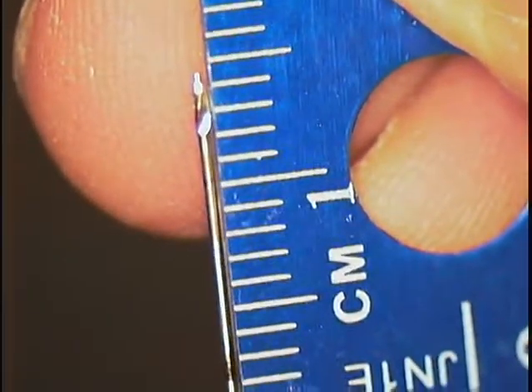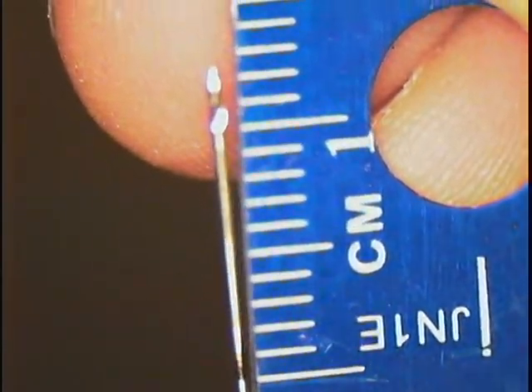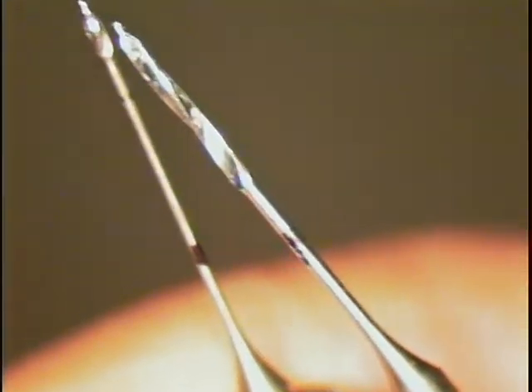So take your burr and your Sharpie, go ahead and measure 14 from the end. It looks about 12. Okay, so we're about 12. I think that's what we marked. 2/3, okay, of the length. Put your Sharpie marker there. And you might as well just go ahead and do it on all your burrs. Just line them up, mark them all. This one was marked, that one was marked. Okay, you get the idea. I'll just get through this and you can get going. There you go.